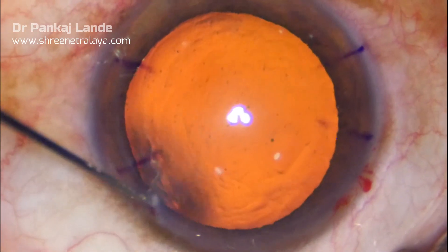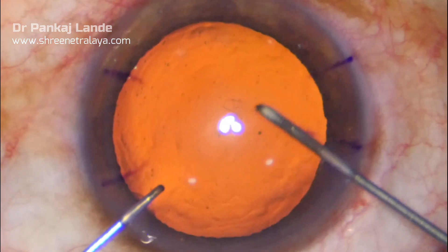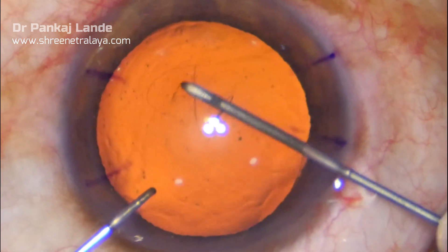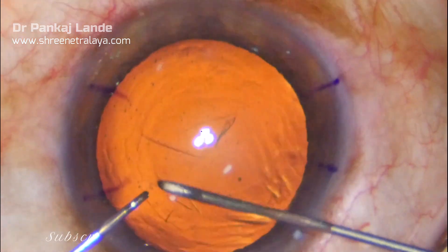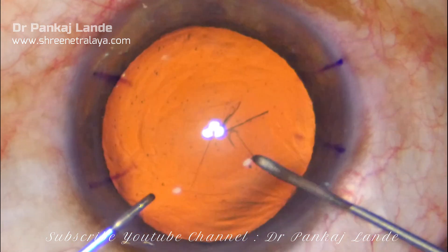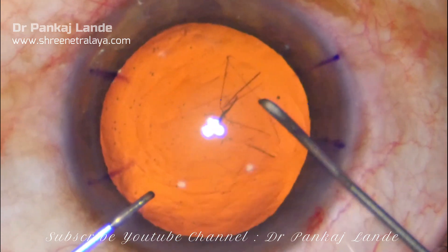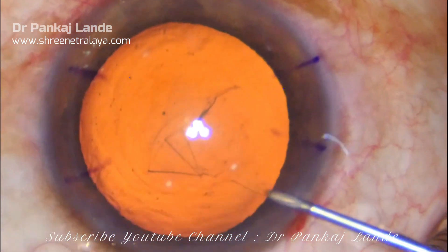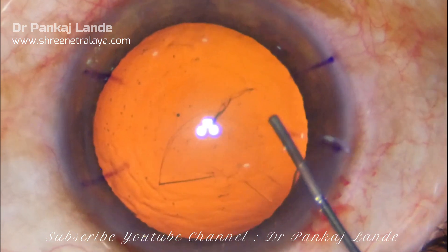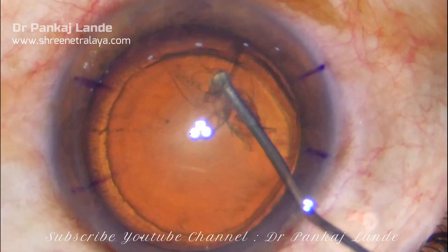CCC is performed under retroillumination glow. Hydrodissection is done and completed.